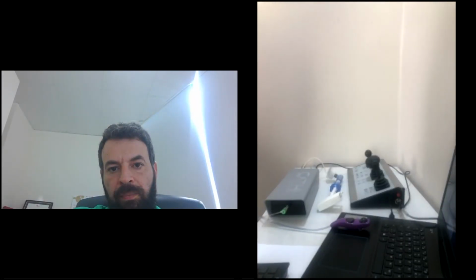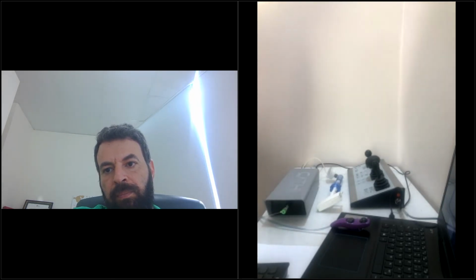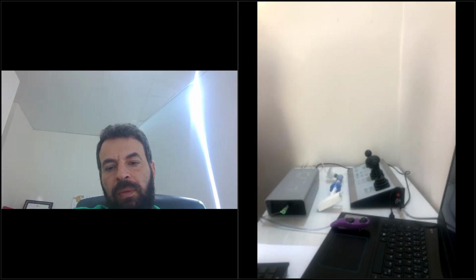Okay, so can you see now the camera of Ahmed Hassan user? We have here the Cathis Smart. I will explain a little bit about the hardware components, and then we will start a real case. Me and Hussam will elaborate more about the case itself. So everyone can see the camera? I can see your camera, yes. Please, Hussam, put yourself on mute. Everybody puts on mute, so the camera of Ahmed would be always showing.